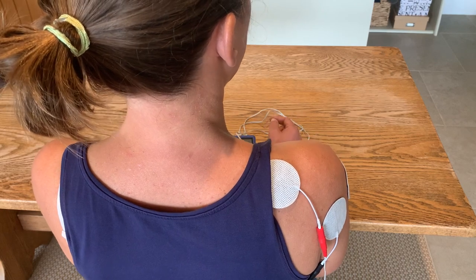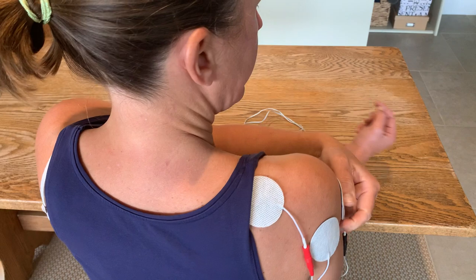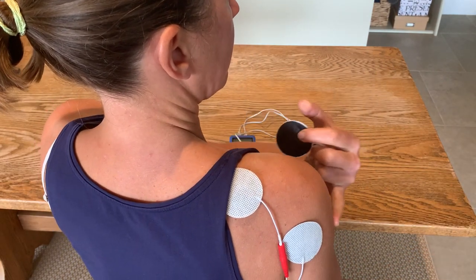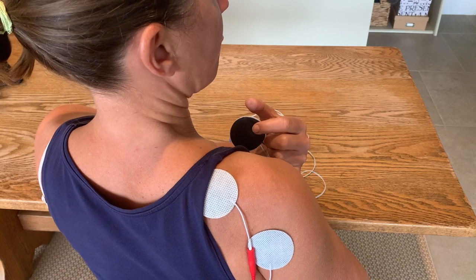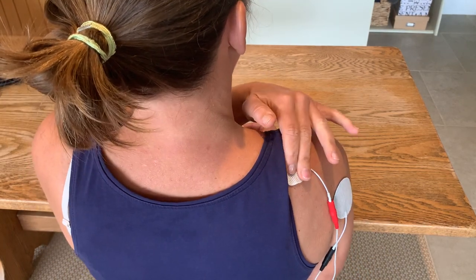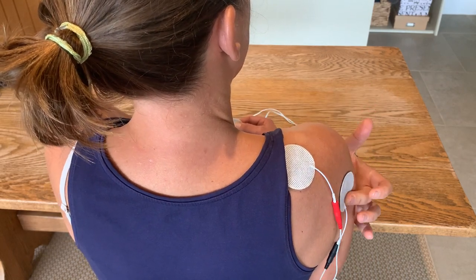Setup number two: if you just have one channel and one lead, you would remove two electrodes. Remove the mid upper arm and the one right round at the front, so you're left with supraspinatus and the one at the back of the upper arm, which is posterior deltoid.